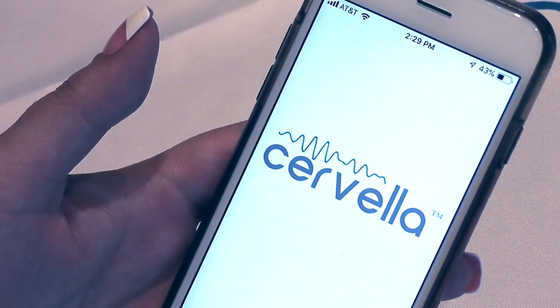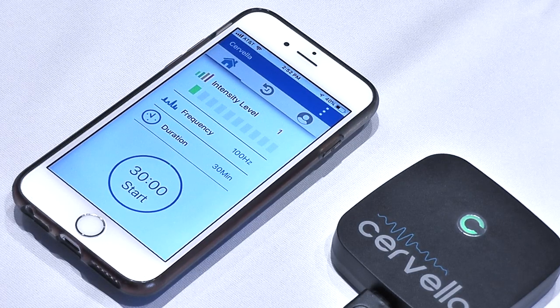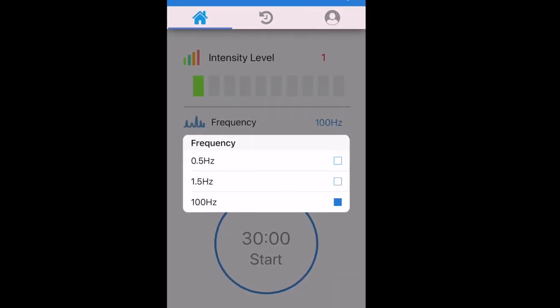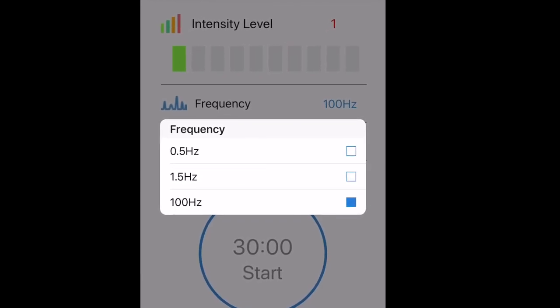Launch the Cervella app. The app will start in the home menu. Select the treatment frequency. The default and most widely used and studied frequency for cranial electrotherapy stimulation is 100 Hz.